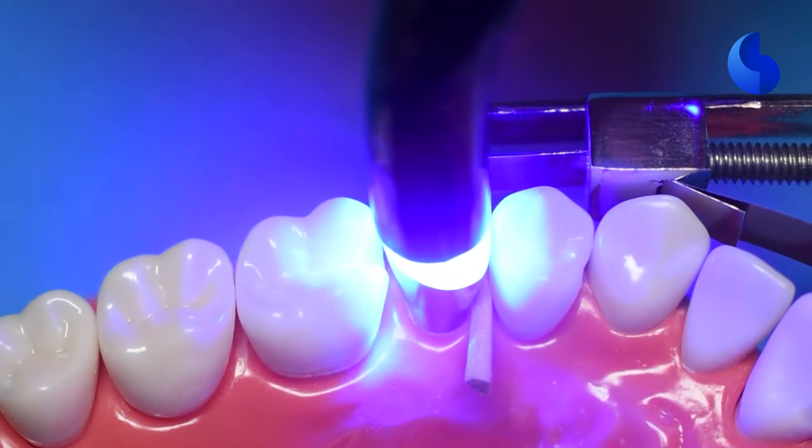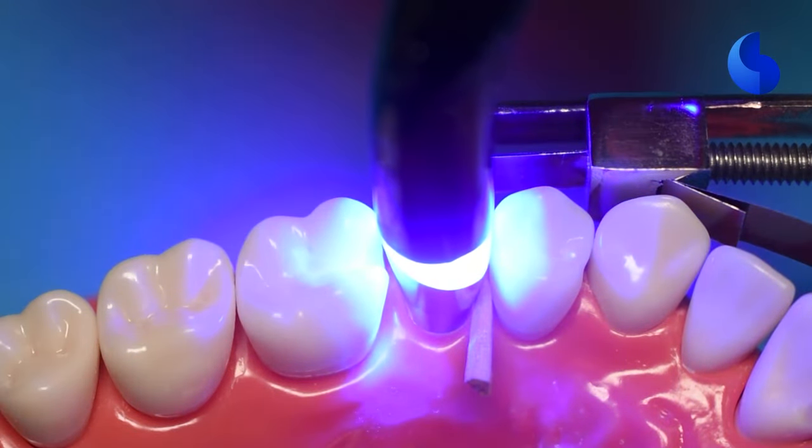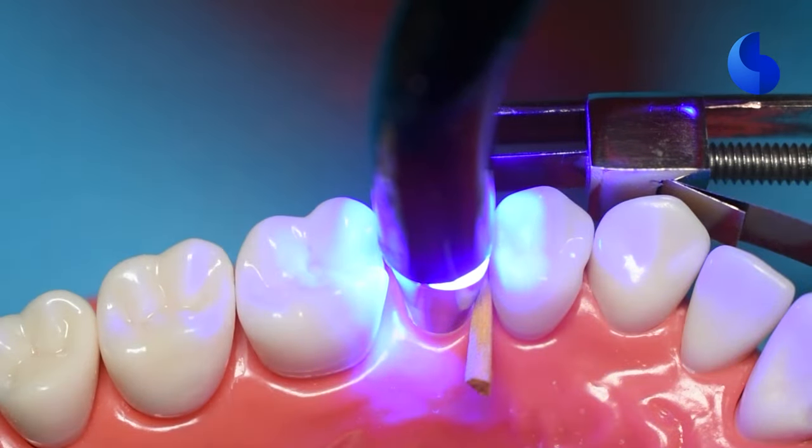We always like to use a little bit of bonding agent in our tooth when we restore it, even though it's a plastic tooth, because it helps to close some of the voids. Your composite restorative material might not flow everywhere as you'd like it to flow. So the best way to prevent that is by using a little bit of bonding agent and then cure it before you move on with placing your composite restorative material.